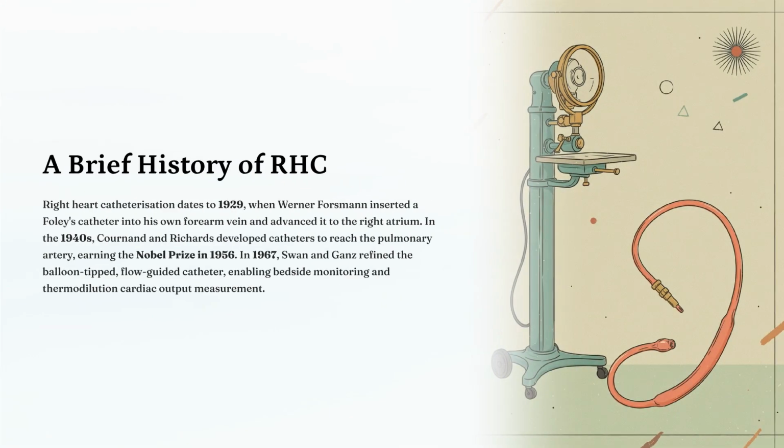Right heart catheterization has a rich history dating back to 1929. Significant advancements in the 1940s and the 1967 refinement of the balloon-tipped, flow-guided catheter by Swan-Ganz have been pivotal, enabling bedside monitoring and cardiac output measurement.